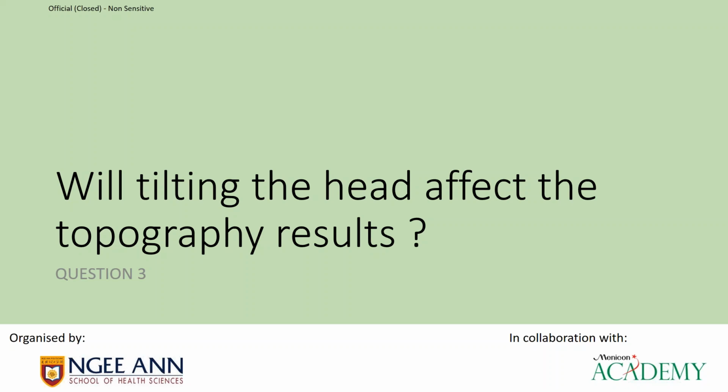And the moment you have to assume stuff, there will be mistakes. So if you have to tilt, if you have the patient upside down, do it, but just create good images. Yeah. All right. Thank you for the answers.